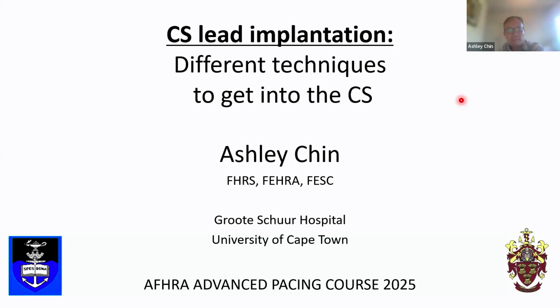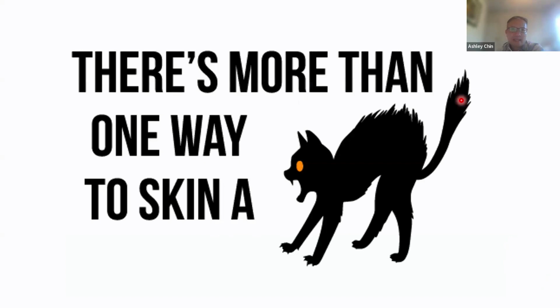I'm going to give a talk on the different techniques to get into the coronary sinus. And I realize that there's more than one way to skin a cat. There's more than one way to get into the coronary sinus. And I'm not going to pretend to tell you that my way is the best way. There are many, many different ways. And I'm going to show you a technique that I find quite useful.